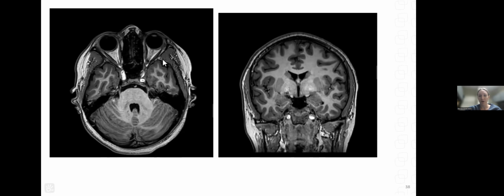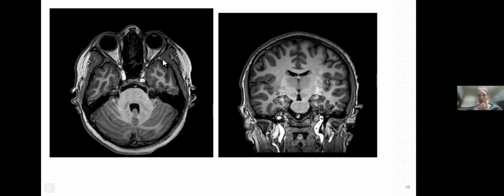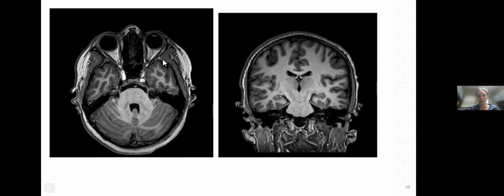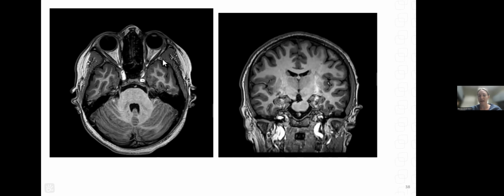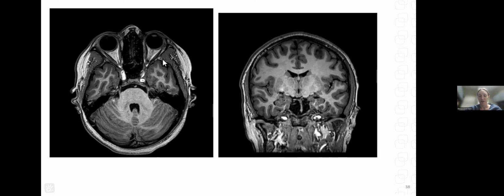We're looking at a coronal cut. And again, you will see these hyperintense, not normal looking areas in the deep structures of the brain. And it'll go back through it one more time. Right there. So you see those hyperintense areas and you're like, wow, is that pathology? What's going on? I'll stop here in a second.